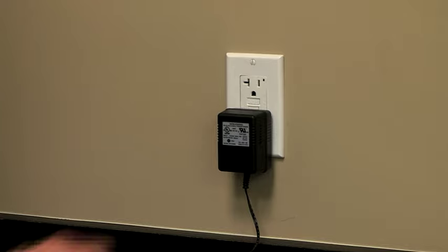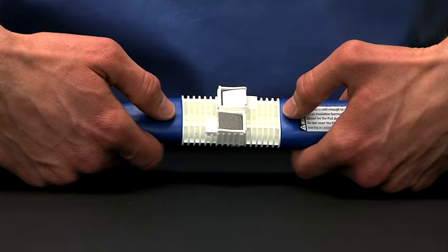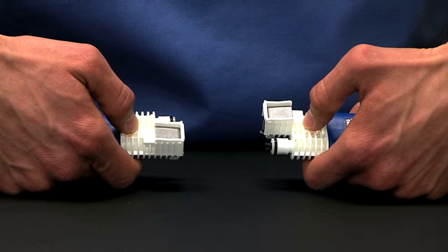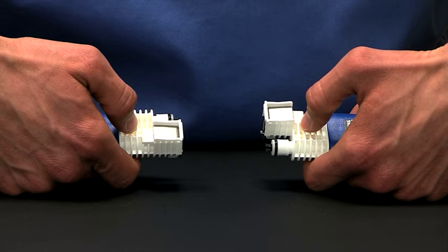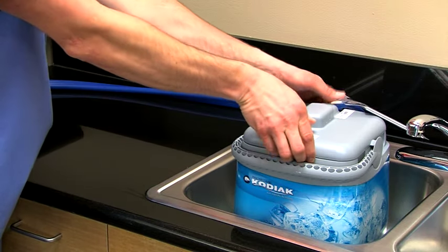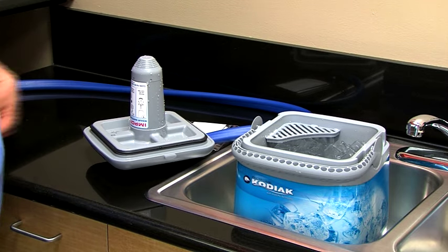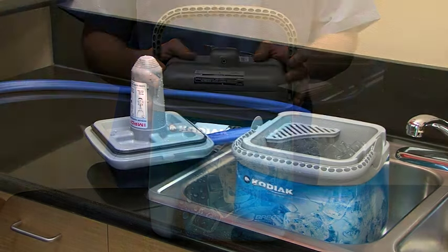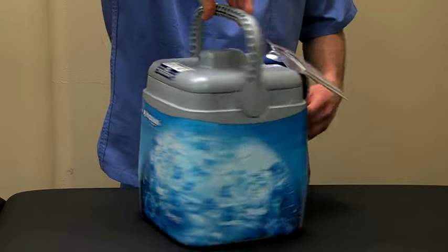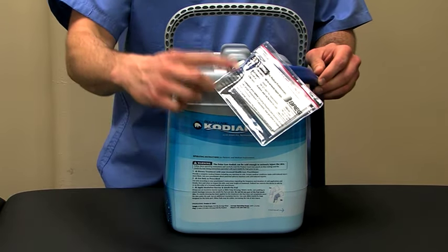To stop or refill the unit, unplug the unit from the electrical source. Disconnect the pad from the unit by depressing the two metal tabs and gently pull the connectors apart. The pad will seal itself and won't leak. Some dripping during release is normal. Turn the lid upside down and place it on a flat surface so extra water gathers in the lid, then refill the unit with cold water, then ice. If you need a reminder regarding how to use the PolarCare Kodiak, refer to the operating instructions printed on the wraparound label or the product insert in the pouch on the hose.